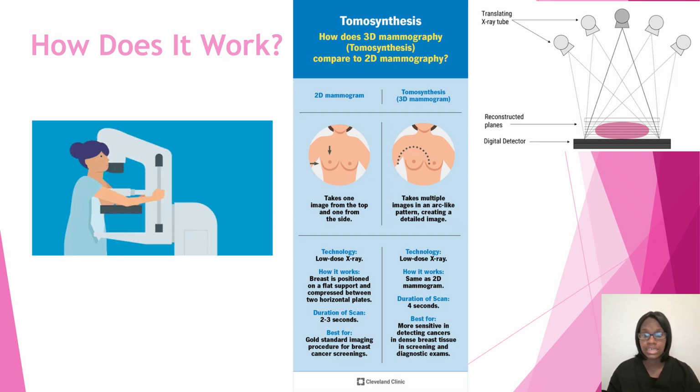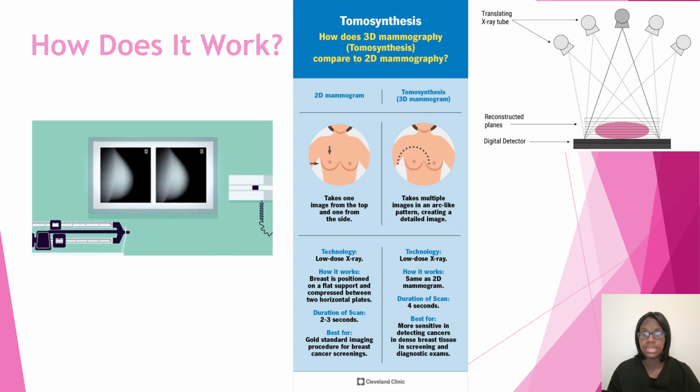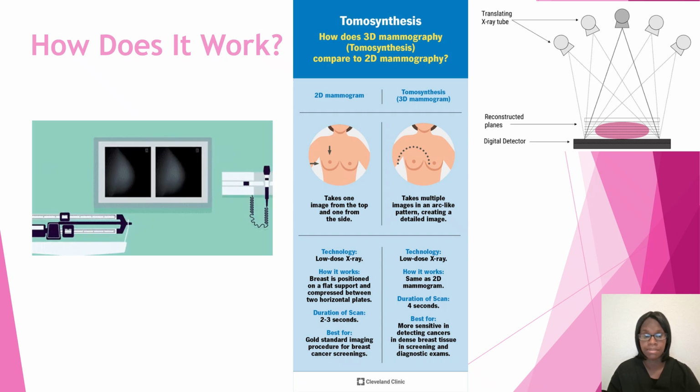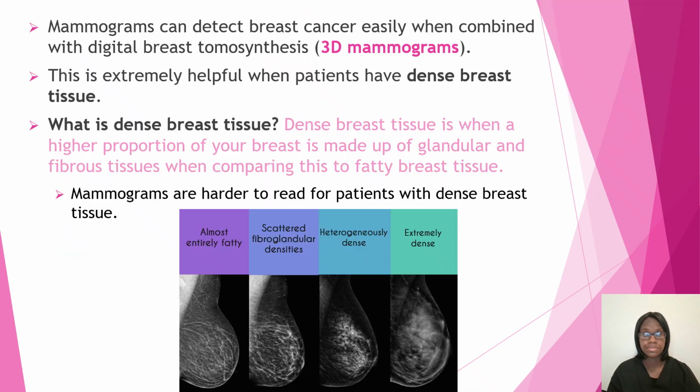For 3D, this is going to be more sensitive in detecting cancers in breast tissue, especially on screening and diagnostic mammogram exams. Your mammogram can detect breast cancer more easily when it is combined with digital breast tomosynthesis, or your 3D mammogram. That's pretty much the same thing. This is extremely helpful when patients have dense breast tissue. So, are you familiar with dense breast tissue? Do you know what it is?